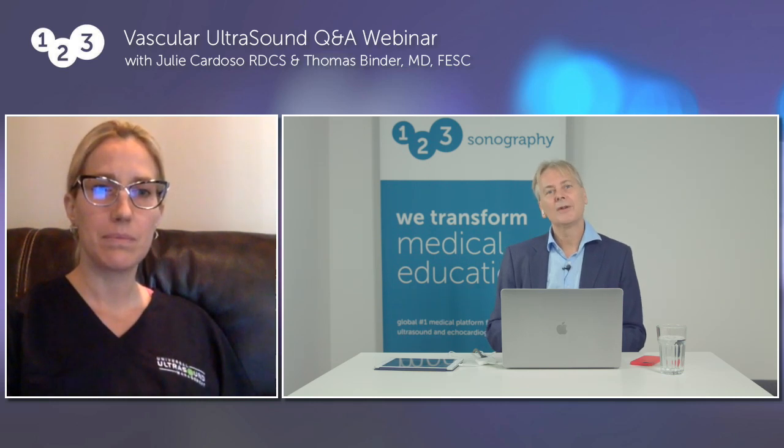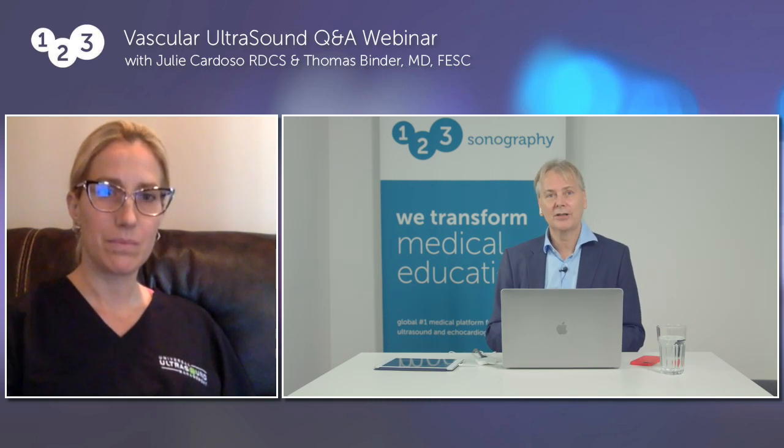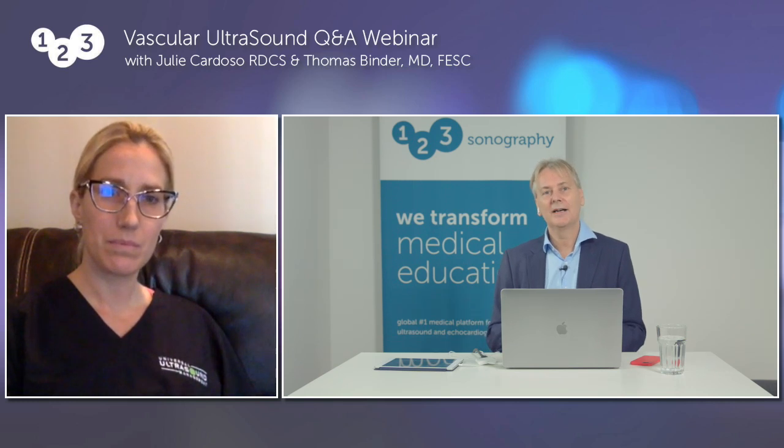Yeah, I think there are so many issues. It's also how hard should you actually press? Sometimes we're just overpressing and that causes a lot of strain. Sometimes it's not necessary. And these are issues that have actually been looked at in research publications, trying to figure out how much the pressure needs to be. So there are a lot of studies being done in this area as well, and I think it's very important too.